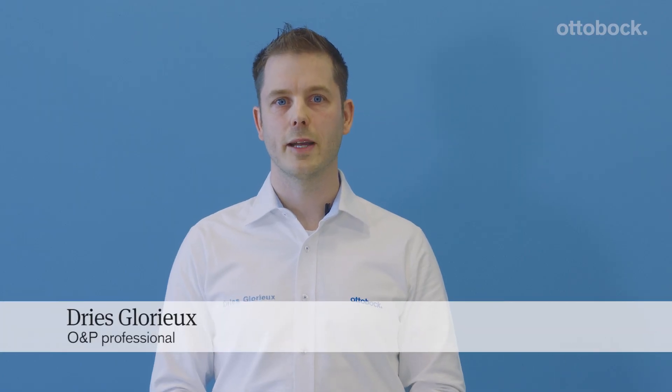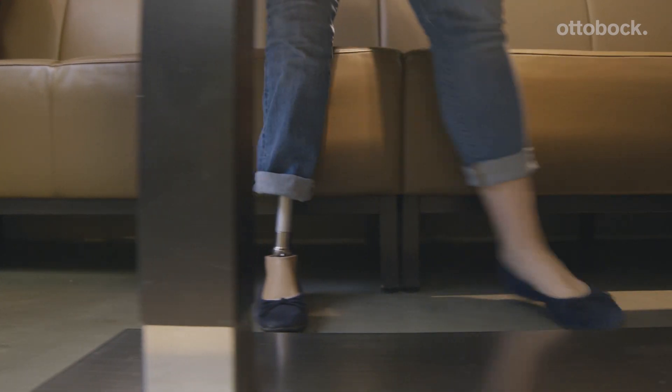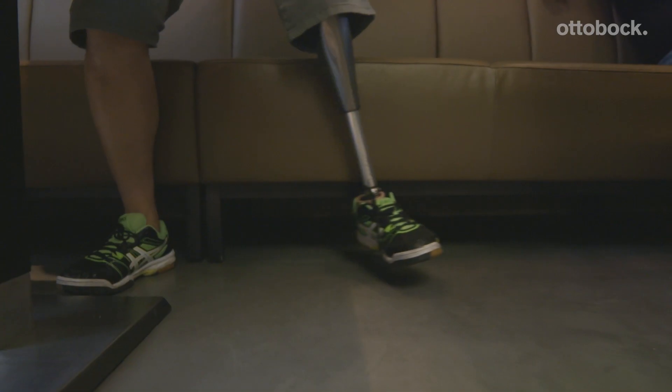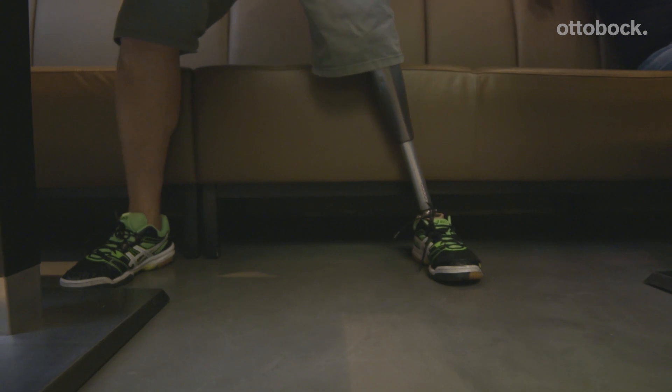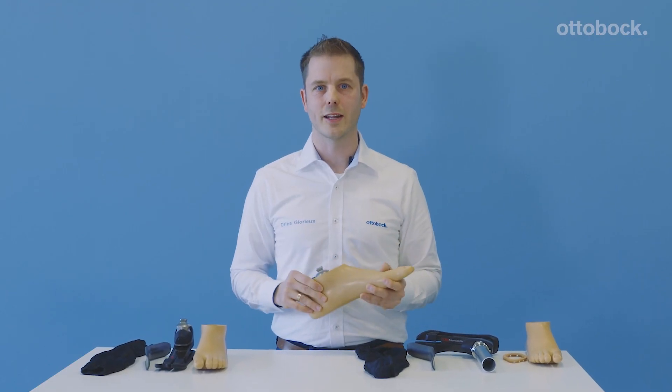Hi there. I'm really proud today to show you the latest member of the Triton family. It's the Triton Sideflex, or the 1C6080. It's a sideways flexibility that is really beneficial for the end user. Today I want to show you how to don and doff the footshell around the Triton Sideflex.